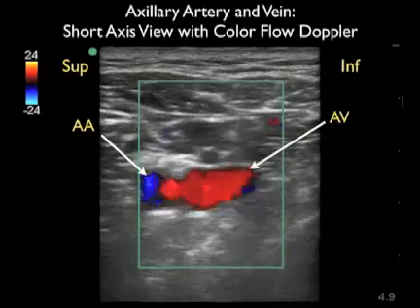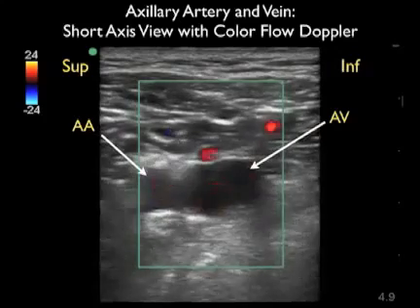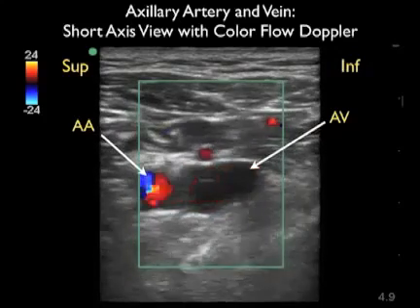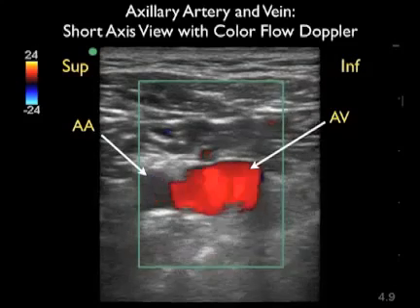Notice here we also see phasic respiratory flow within the axillary vein corresponding to inhalation and exhalation by the patient. Thus, another way of differentiating the axillary artery from the axillary vein.